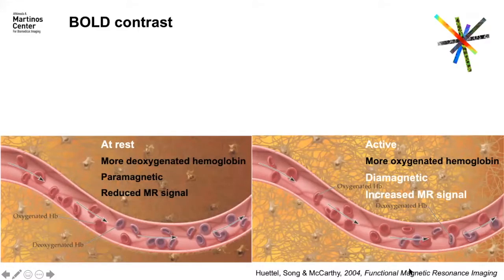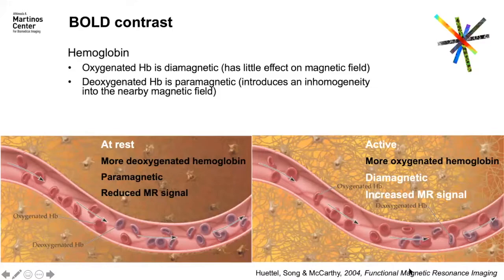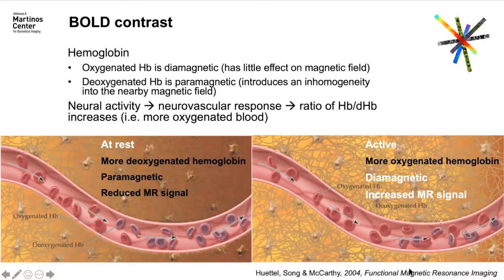So basically, in BOLD contrast, we take advantage of the fact that the hemoglobin has different properties when it's oxygenated, or carrying oxygen, or when it's deoxygenated.